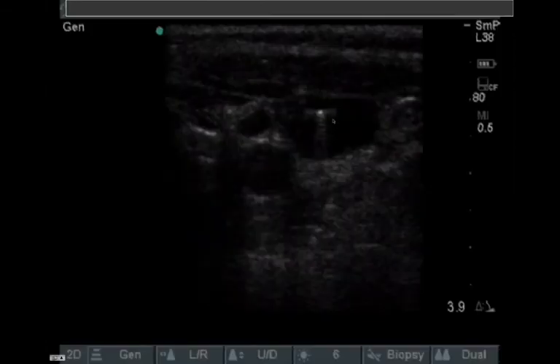This is a picture of a needle transversely inside an internal jugular, and you can see it looks wider than it is. You get the central bright echo here, and then these sort of wings on either side, which are artifact, and that is because the beam that comes down here, the edge of it hits the wire, there's some reflection back, although not a huge amount, and then the ultrasound image is cast saying, okay, well, from the line that I think is coming down here, there's a little bit of reflection, so we'll make something grey here, which is in fact reflection coming from this.